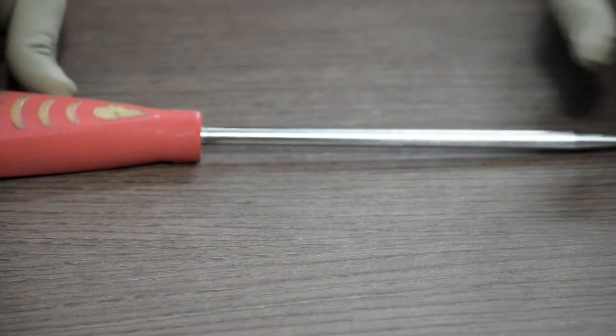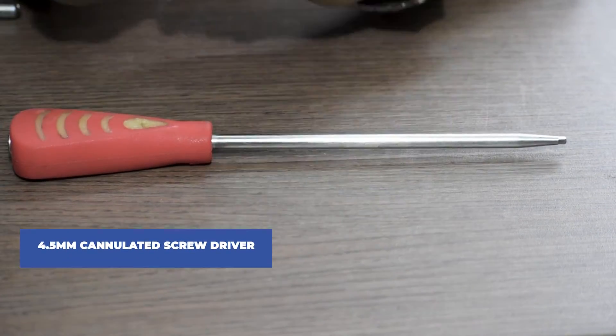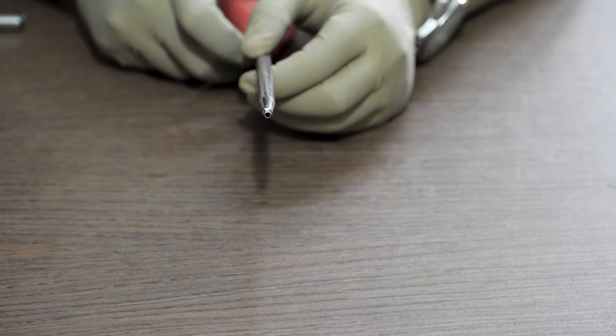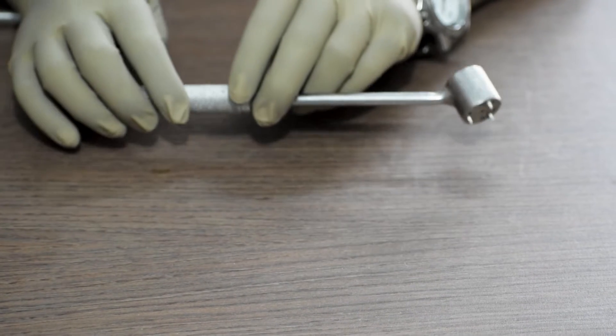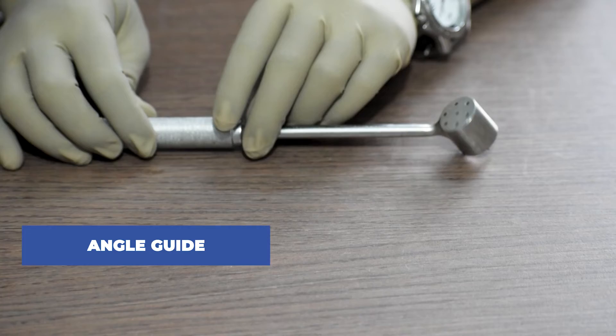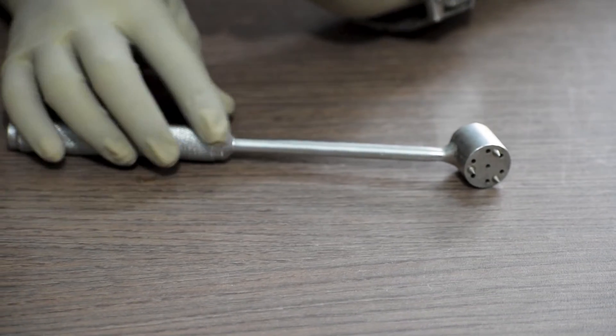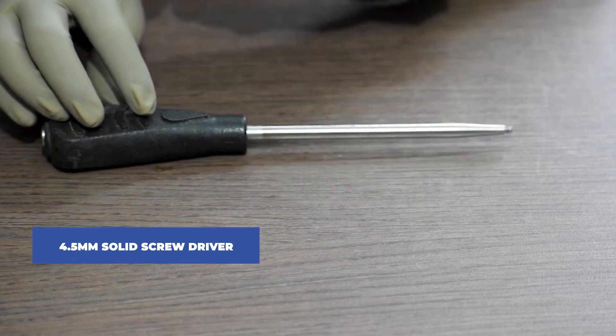Coming to screwdrivers, this one is a 4.5mm cannulated screwdriver. See, here it's cannulated. Next, we will require an angle guide. This is a very vital piece of instrument. Next, we will require a 4.5mm solid screwdriver.